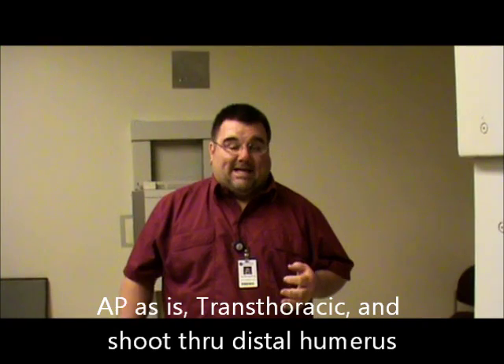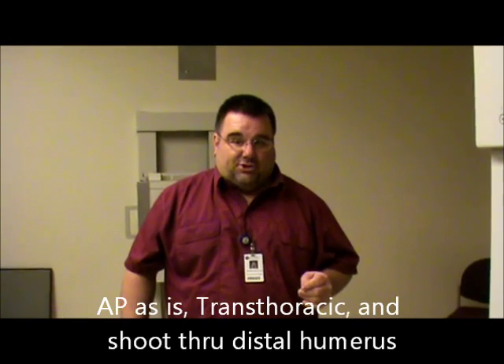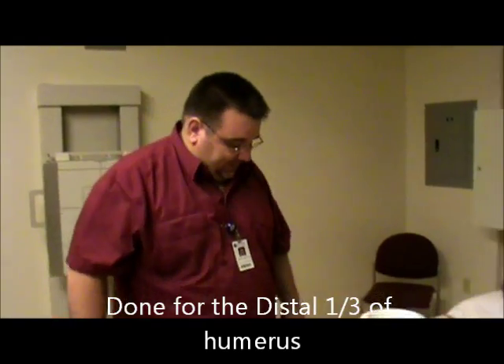Today we're going to be demonstrating the shoot-through distal humerus view. The views we did previously were the AP as-is humerus and the transthoracic humerus. The view we're going to be doing here is a shoot-through to see the distal third of the humerus. This is for a patient who's unable to move their arm, so we're going to take a shoot-through to see it.